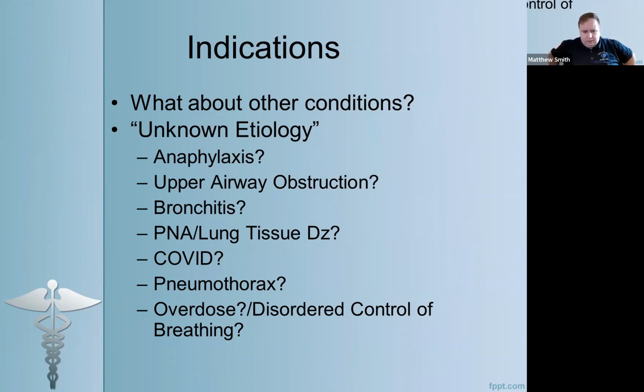Risk benefit here. There is a risk to the providers. CPAP is used to treat patients with COVID, but when we talk about aerosol generating procedures, CPAP is right up there as one of the most aerosol generating. So if you can possibly temporize the patient and get them to the hospital without initiating CPAP in the closed environment of the back of the ambulance and exposing everybody, then I think probably to everybody's benefit to do that. If you have a patient that needs it, then yeah, you can use it.